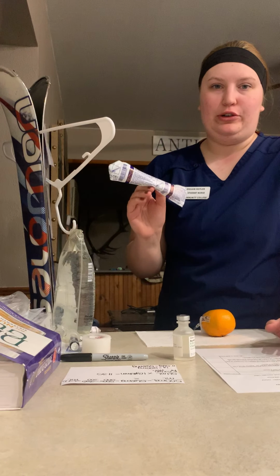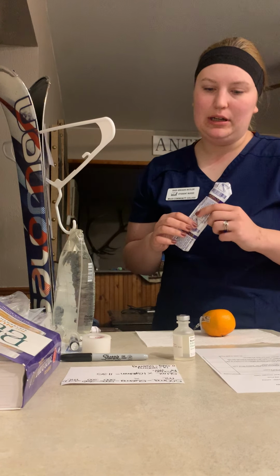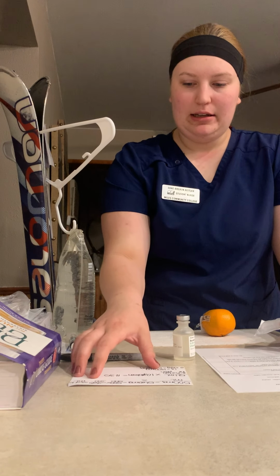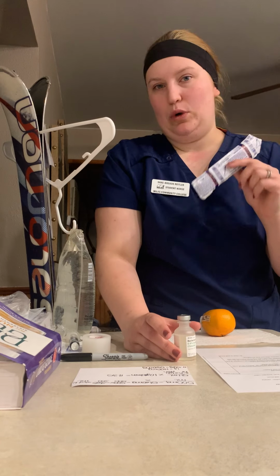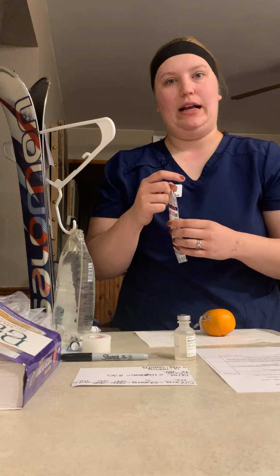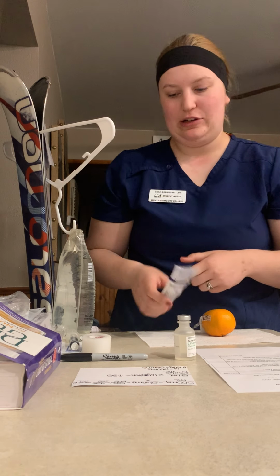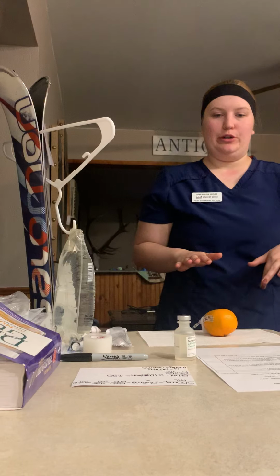You want to make sure you gather the appropriate size needle to take out your medication too. So when I calculated how many milliliters I'm going to pull out from this, I got 1.1. So I chose a 3 milliliter syringe so that I can more accurately pull that medication out. So I gathered all my supplies. I'm heading to my patient's room.